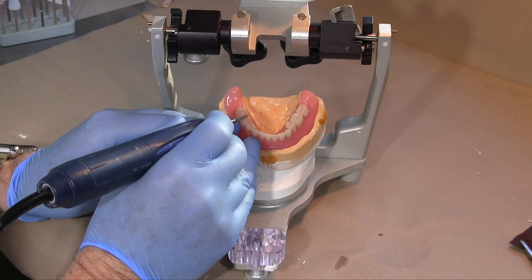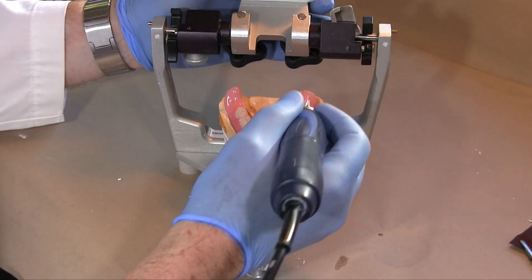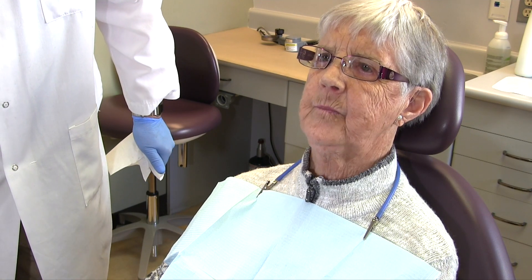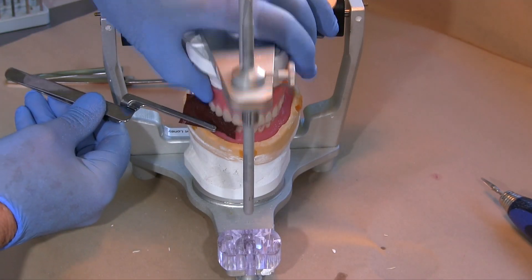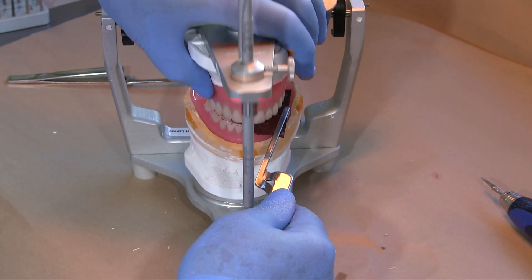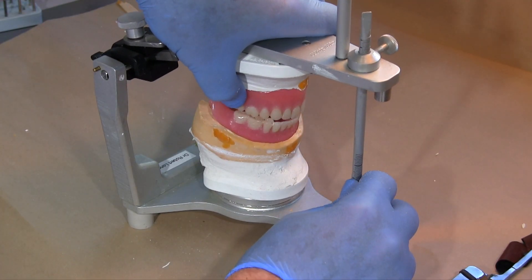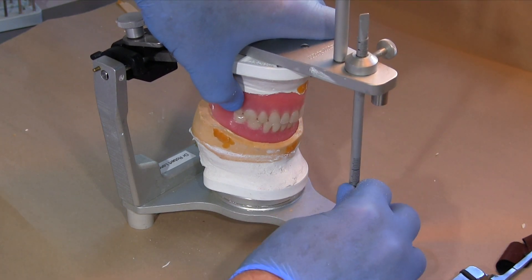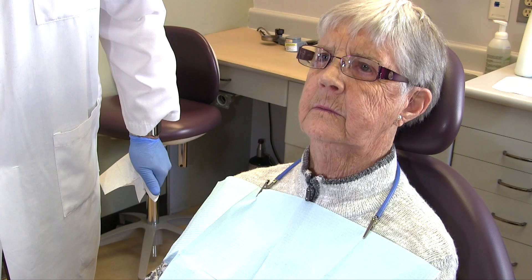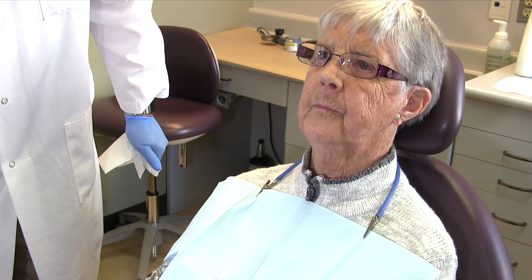Use articulating paper to adjust the occlusion, paying particular attention to those teeth identified as problem areas using the chew test. On the articulator, centric contacts should sound like a sharp loud knocking when the centric contacts are even and not on inclines. Excursive contacts should be distributed with no bumps or jumps, and with light anterior contacts in excursions. Once you have adjusted the occlusion to your satisfaction, have the patient try the chew test again.